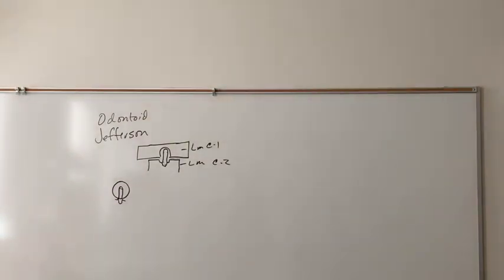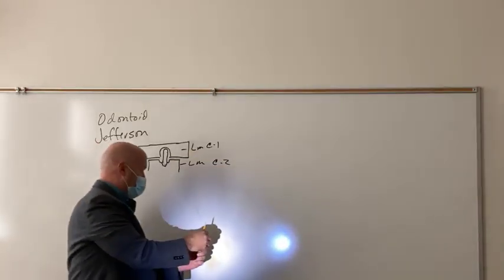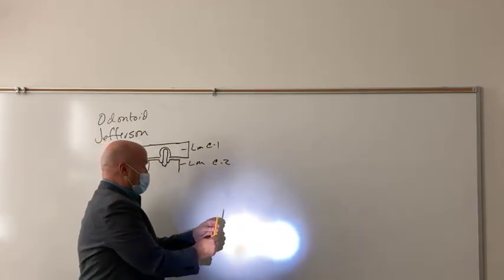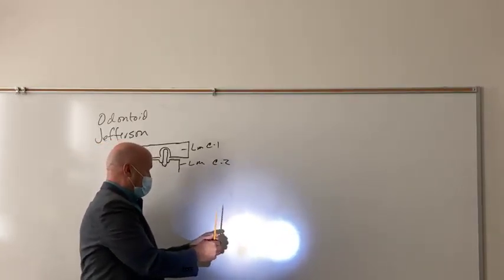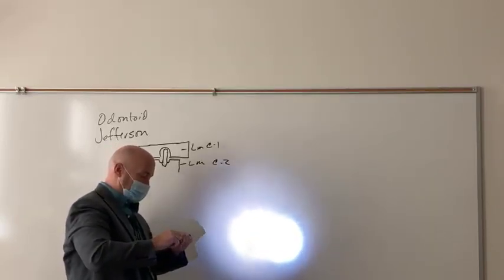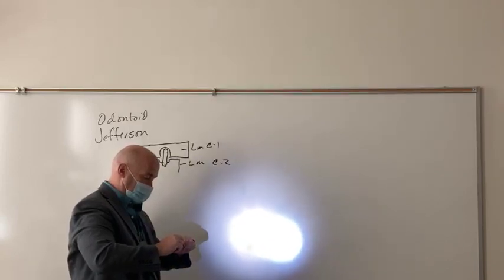Give me some light. Okay. So, again, most of your fractures are going to be at the base of the odontoid process. All right. So, if it's a non-displaced fracture, it's going to be subtle, kind of like a joint space. Match back together.